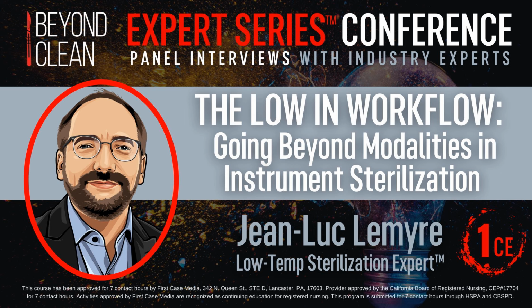just reflecting on my own experience as a sterile processing technician, this is an area that I was a bit mystified by. You know, I had a rough idea how a washer works, a rough idea how a steam sterilizer works, but we have this chemical box that we stick things in, and it's able to accomplish sterility without all of the high temperature. And really, all that we know is it's a chemical process. Rather than using heat and steam, it's using chemicals, and that's really all that the sterile processing technicians get.